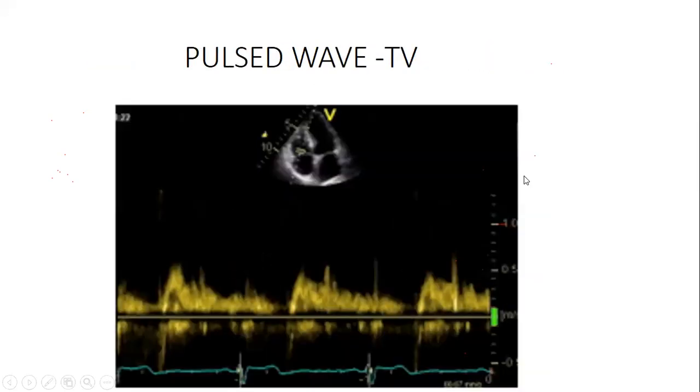Okay. I wanted to show you the normal tricuspid flow. This is how it flows. When you see this, by the way, echo images look so funny, but we pick up a lot of information, and you can only pick up information when you know. The eye sees what it knows. It cannot start talking about things it doesn't know.